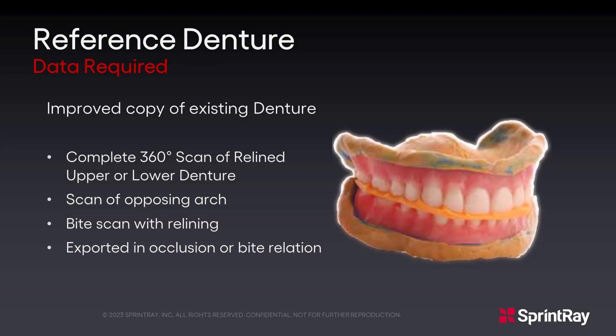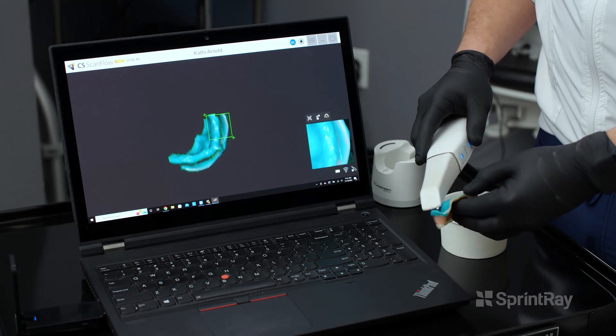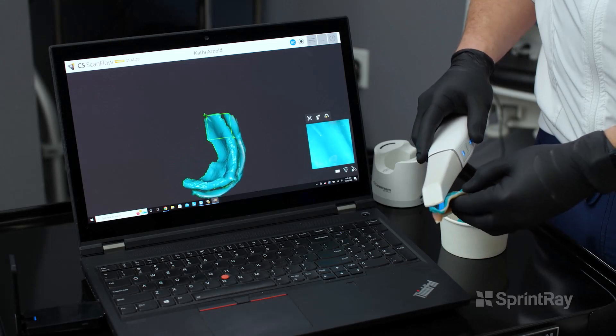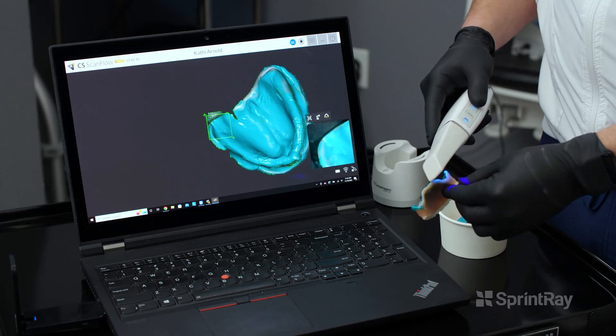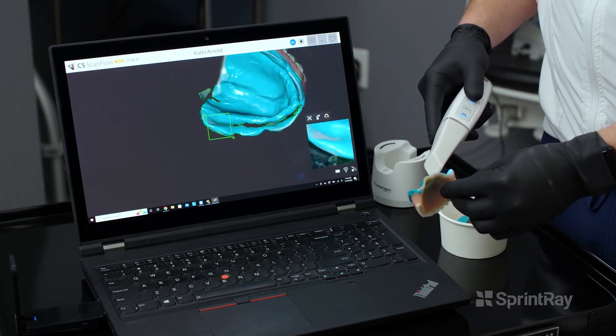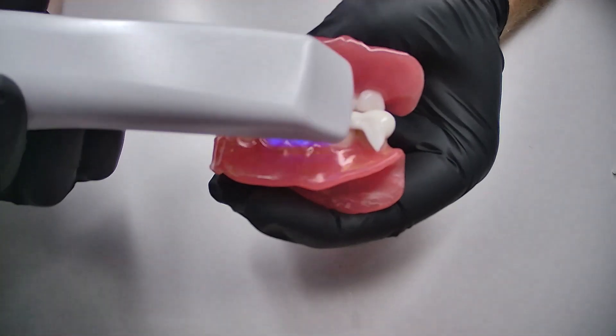A reference denture is an improved copy of an existing denture. In this workflow, we will be doing a 360-degree scan of a relined upper or lower denture, then scanning the opposing arch, doing a bite scan, and then exporting in bite relation. Use the existing denture as a custom impression tray and take a functional impression of the patient's jaw. Then we will be following the same workflow steps as the copy denture. Perform the bite scan in the patient's mouth and export in bite relation.